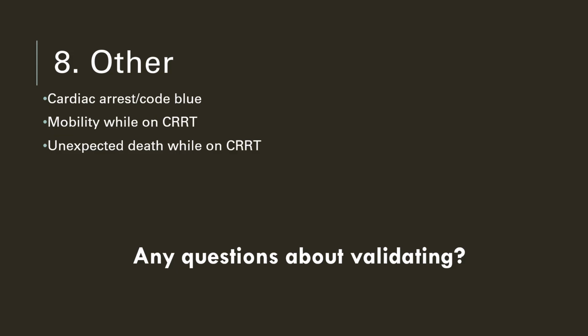If a patient has an unexpected death while on CRRT and the event needs to be investigated, like a coroner's case, the machine should be maintained on with the current settings on. If you have any questions about validating, and I know it's a lot different in the eICU since you won't have the machine to actually do it, please feel free to reach out to me.